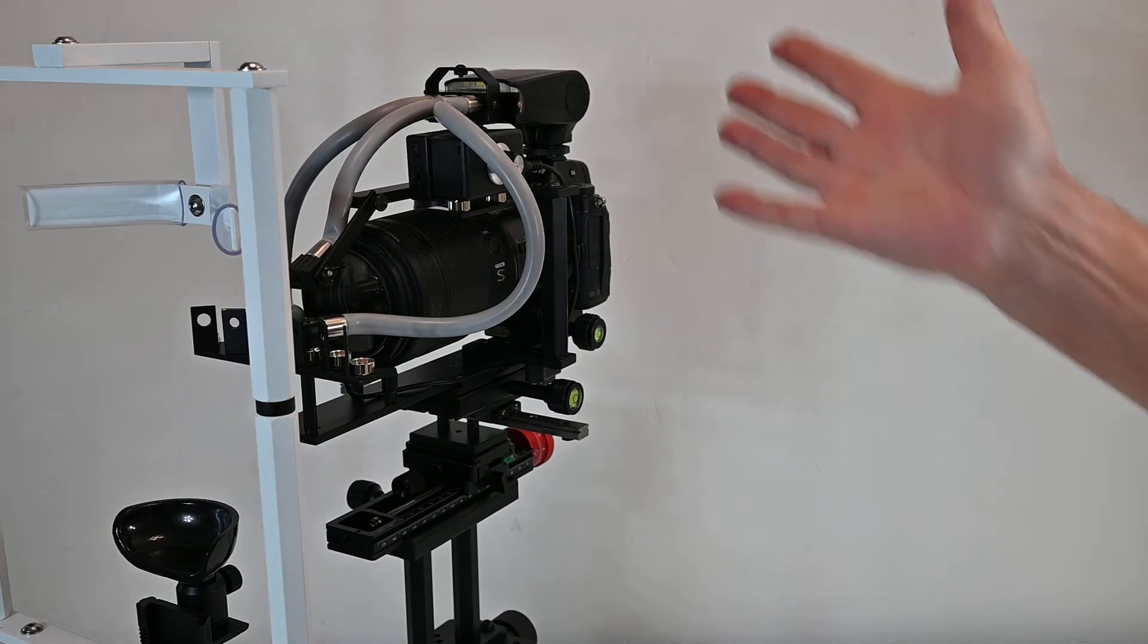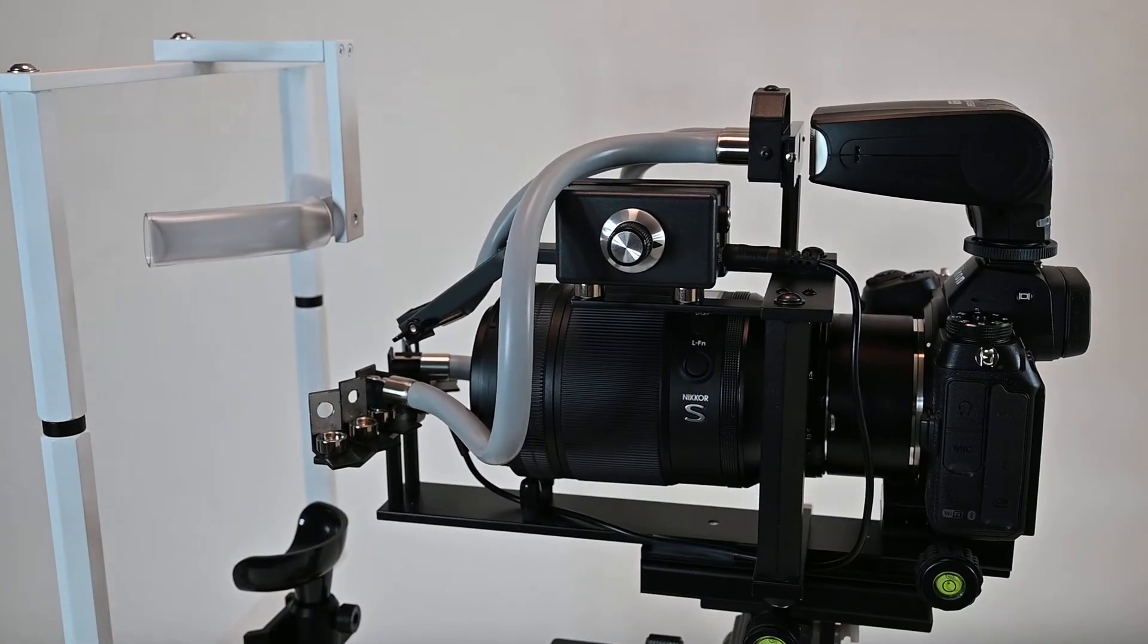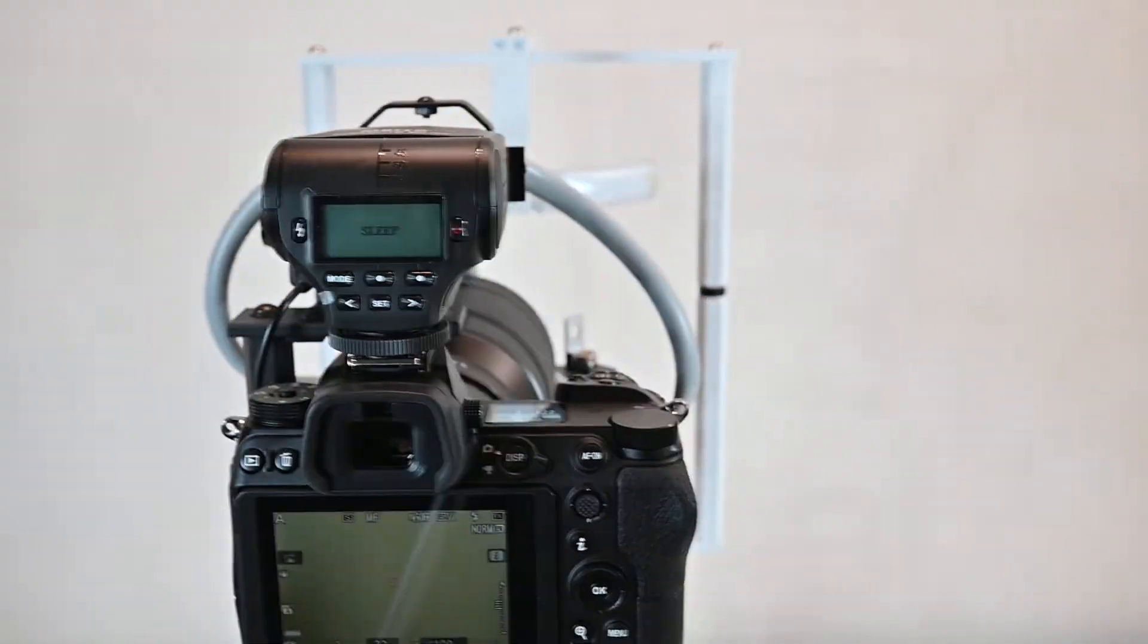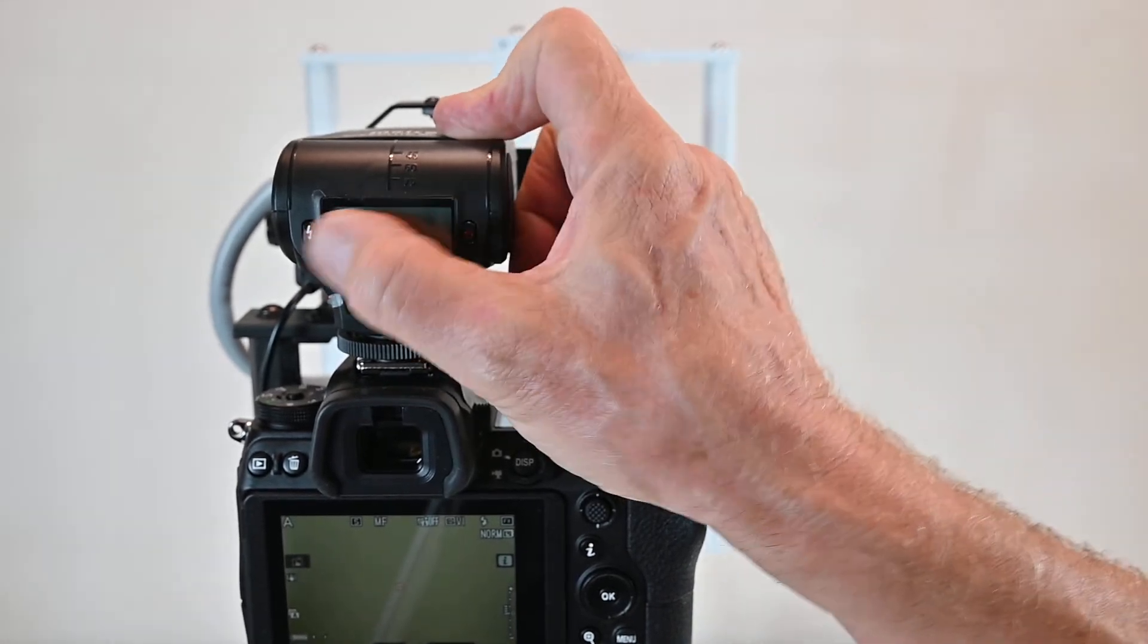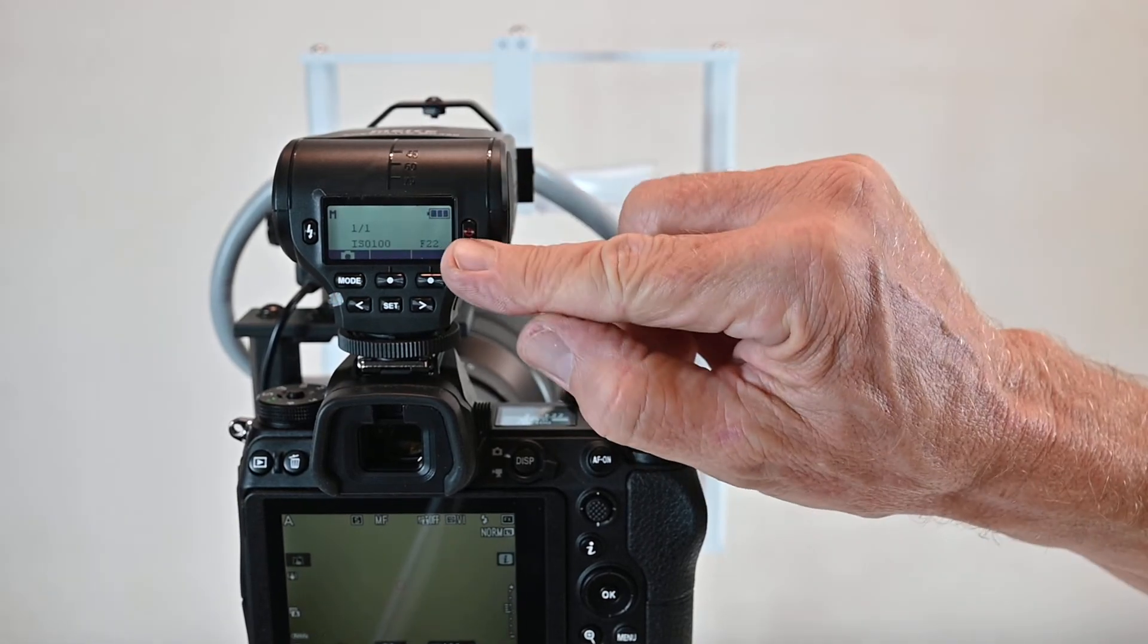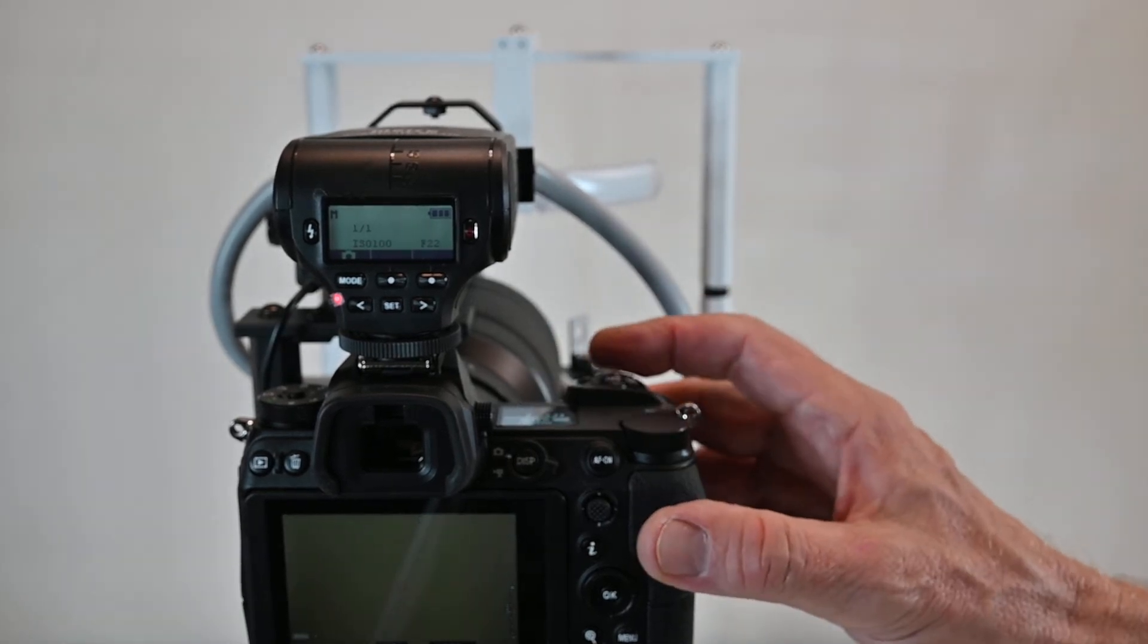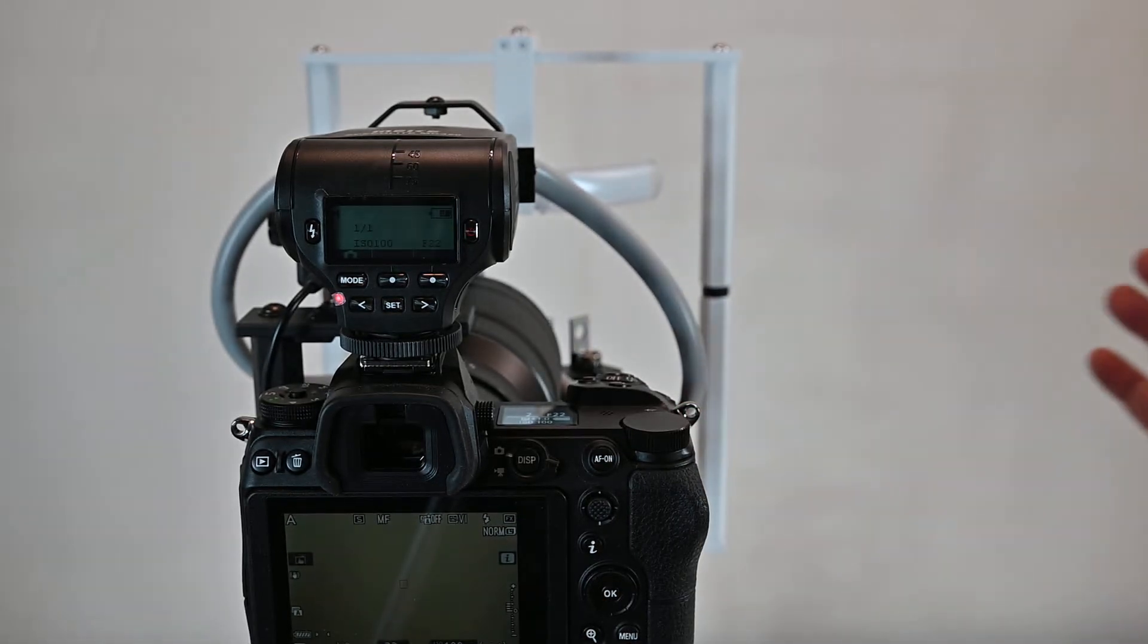Basically that's all there is to the setup and the operation. To power up the camera, you will just turn the power knob here and then press this. The flash will go to sleep after a while, but if you press it and hold it for two seconds it'll come on and it'll say M. You want M for manual.